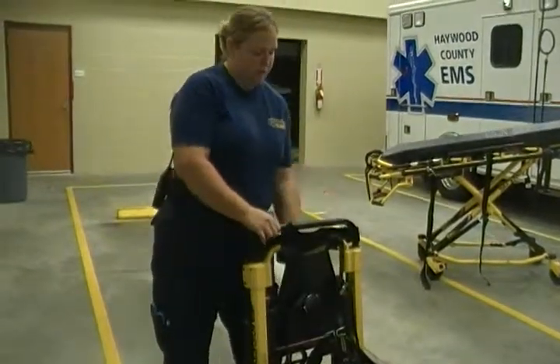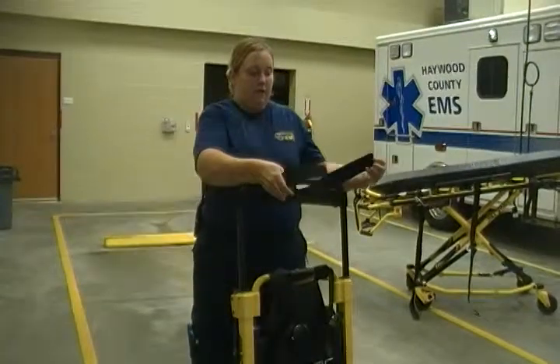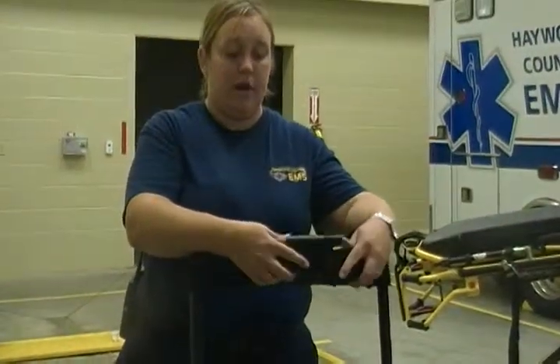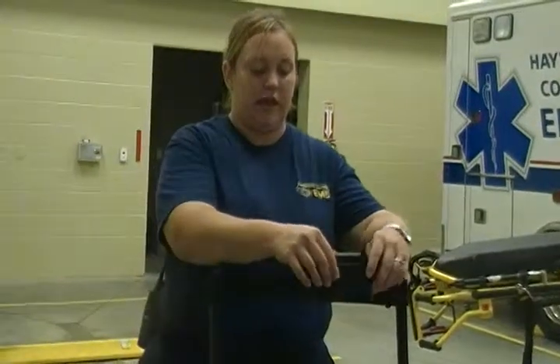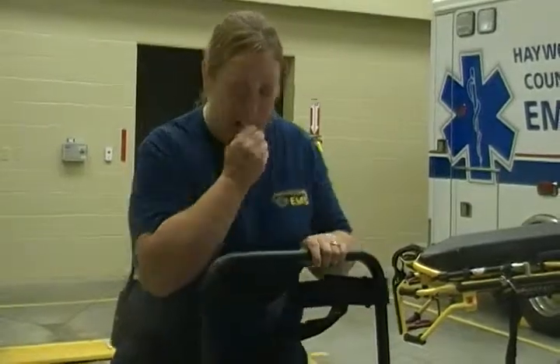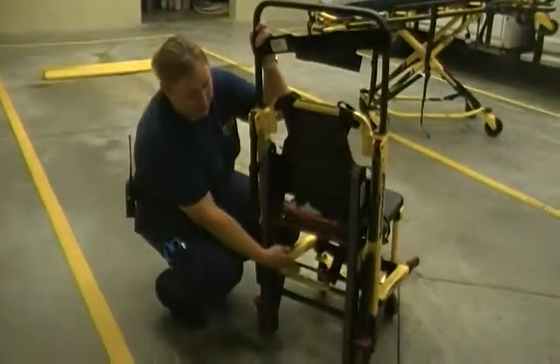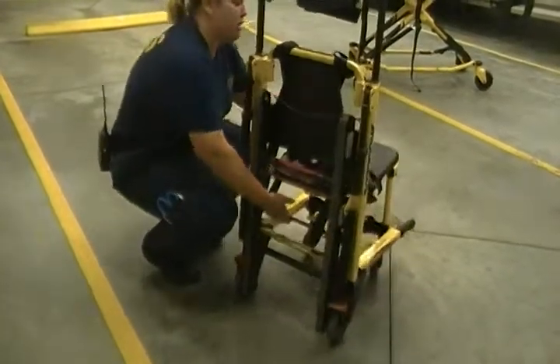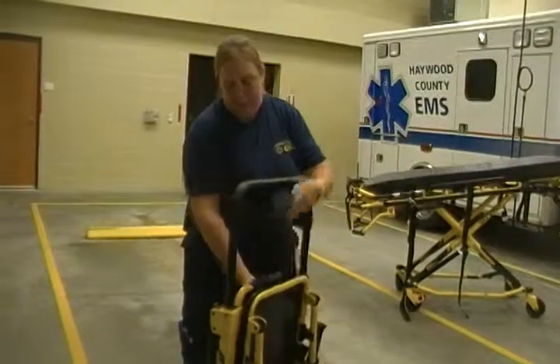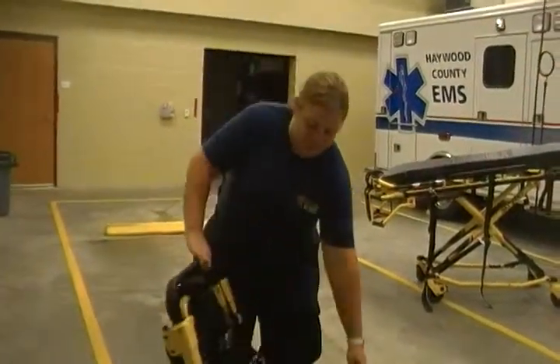Up here on the bar you have a strap — a velcro strap. For whenever you've got a combative patient or a patient that you want to hold in an upright position, you can apply this around their head. It's not used very often, but it's there if needed. Down here on the bottom there's another red lever. This red lever allows you to lift the stair chair back into a folded position, allowing you to put it back in the ambulance.